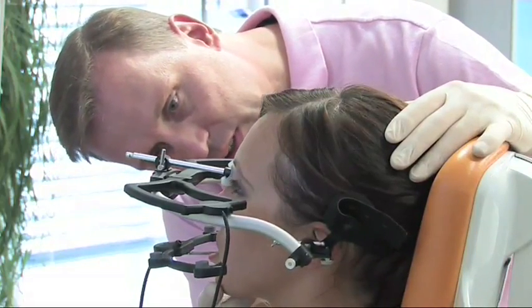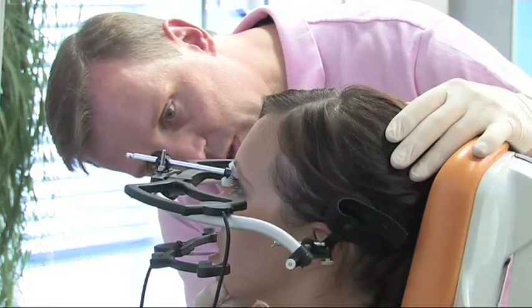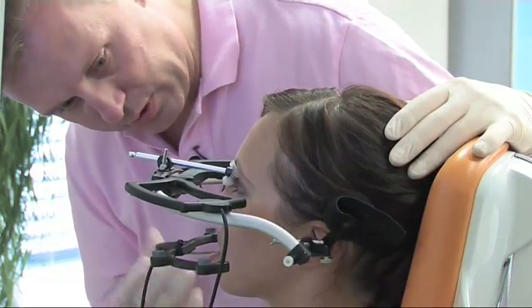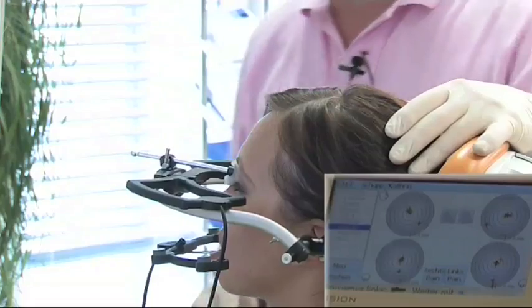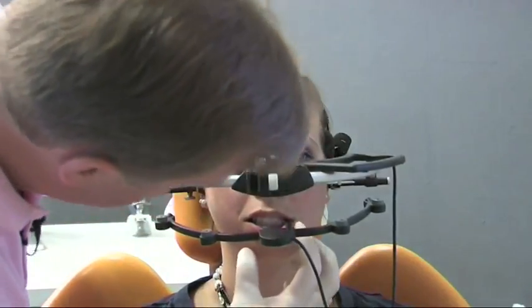Now we are looking for the places where you go to grind your teeth, either at night or when driving or sitting at the computer. Hold still. Okay. And now once again go to the other side.